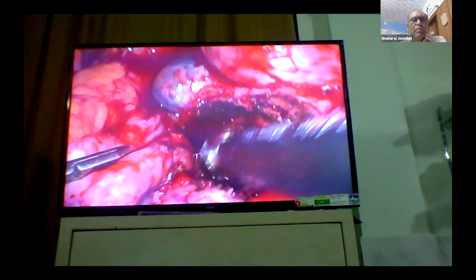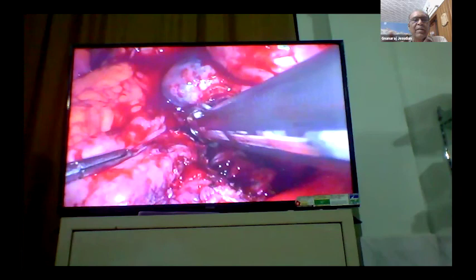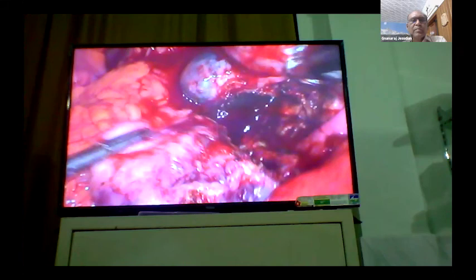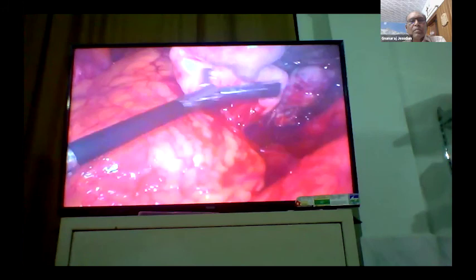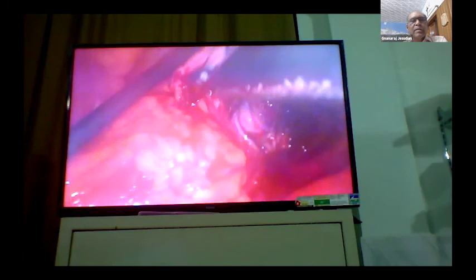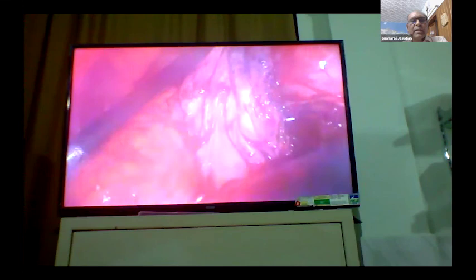In any surgery, the important thing is to have traction and counter traction so that the tissues are tense. If they are lax, then bleeding is there and the planes are difficult to get. So it's important to pull the tissues and stretch them. He has divided almost half of the ovary, and this is probably on the medial side, which is releasing the adhesions, the omentum, which is stuck. And most of the time, blunt dissection would suffice to release these adhesions.